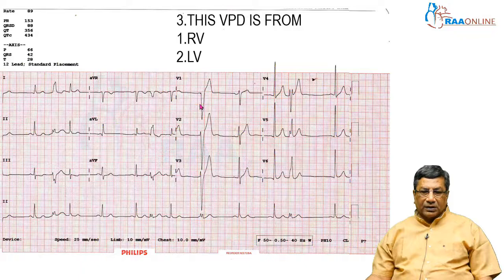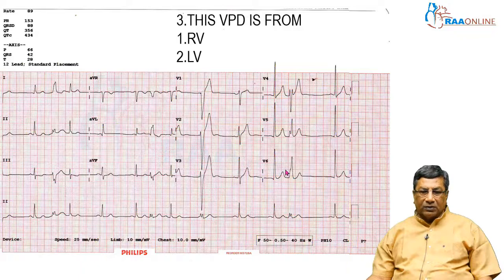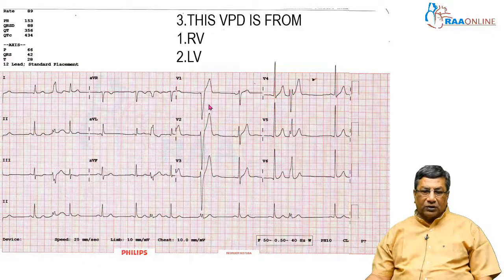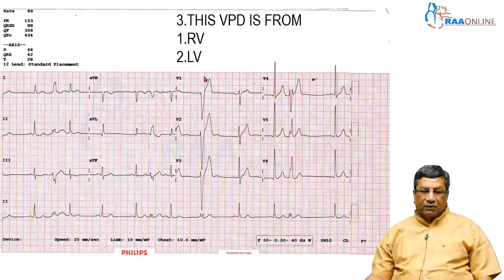Why? Because this premature beat has got very wide QRS, and it looks differently from the sinus beat. We are asking you from which ventricle this VPD is coming from. For that, I asked you to see V1. If the V1 is negative, the VPD is arising from the right ventricle. If the V1 is positive, it is arising from the left ventricle.